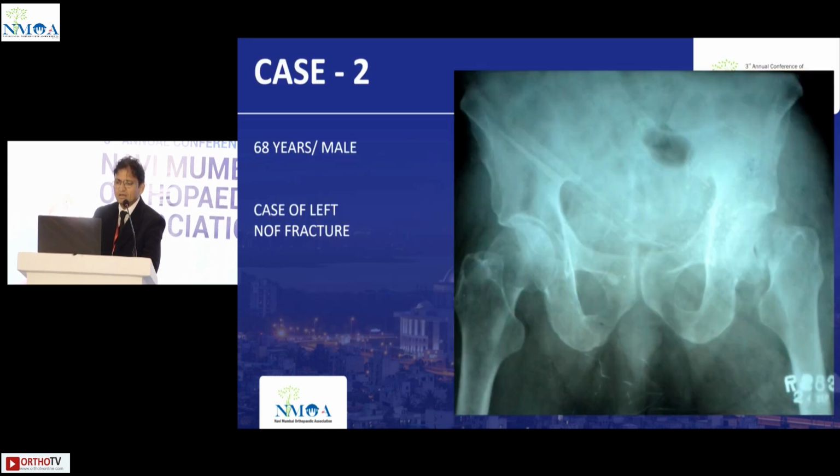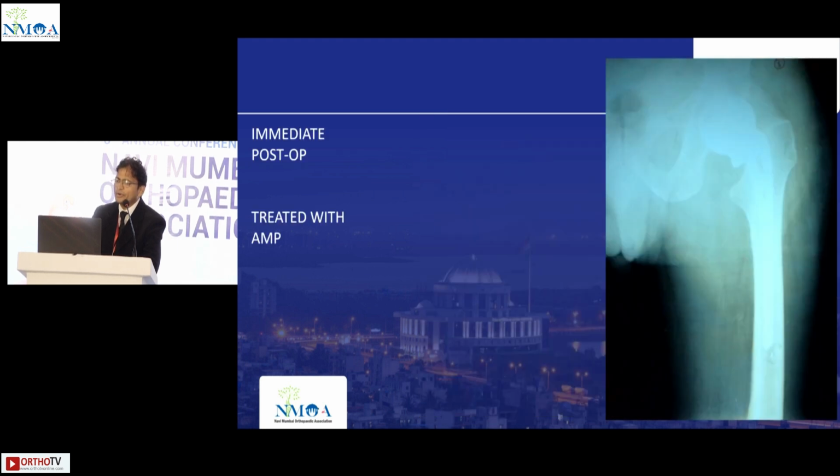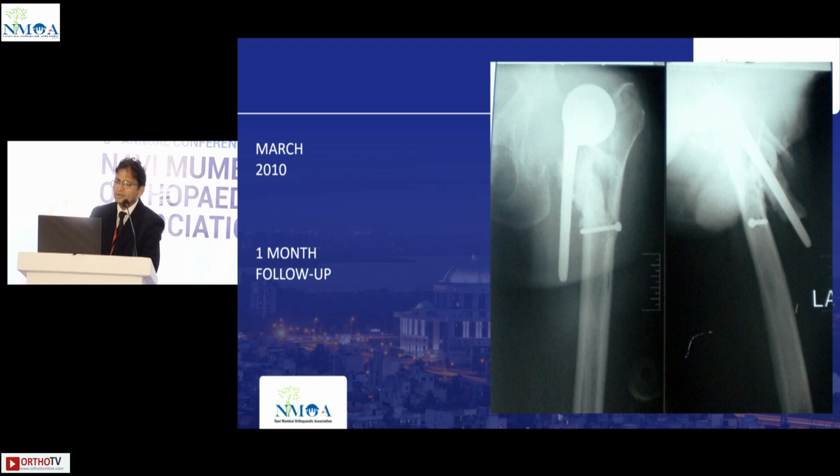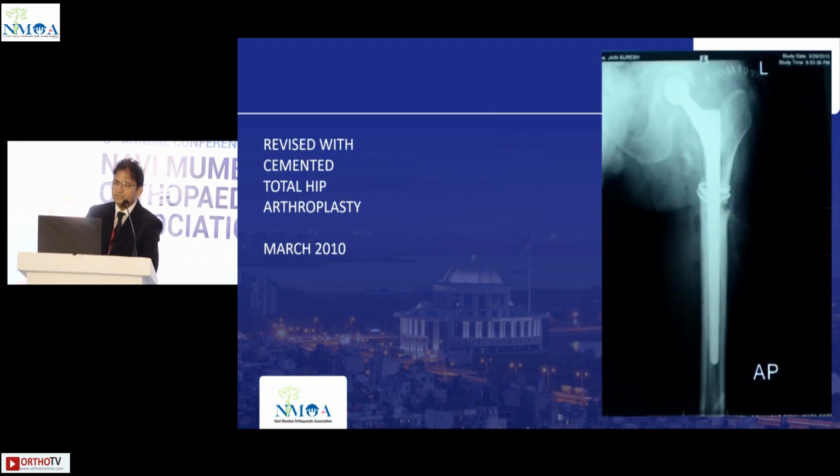Another case, I am sorry for the poor quality of the x-rays. This was a neck of femur fracture operated elsewhere with an Austin Moore prosthesis, way back around 20 years ago. And that surgeon tried to revise this with a bipolar but failed miserably. And he was put to bed rest in the hope that things would resolve, but it didn't for him. And for 6 months he was bedridden, where we inherited this case.